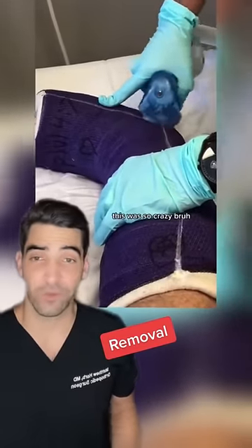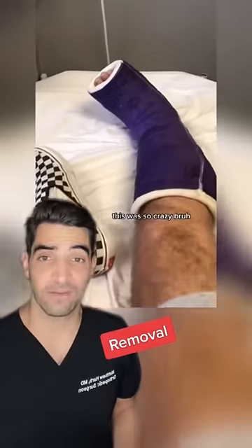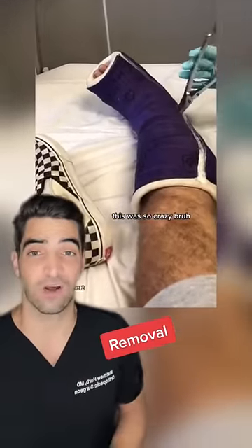But even though it vibrates, if you pushed really hard into the skin, it could cut it. After you perform the bivalve, you'll use a spreader to spread it apart. Once the cast is spread, then you can get it off.